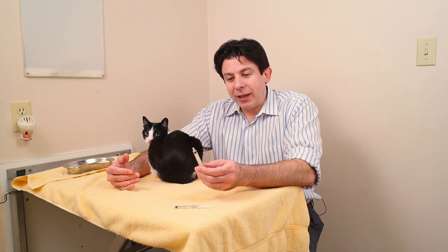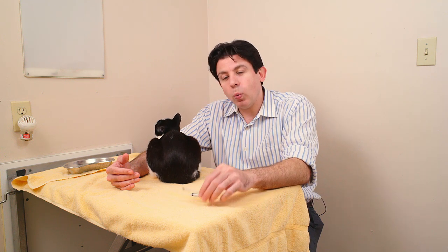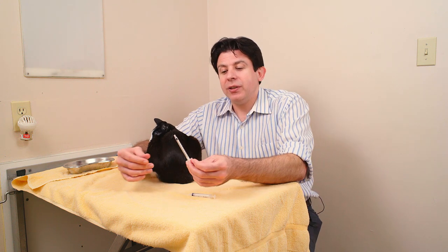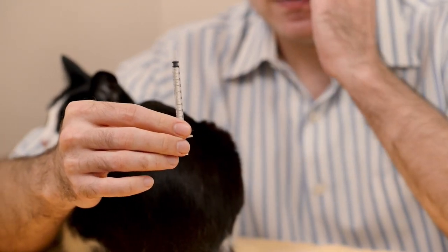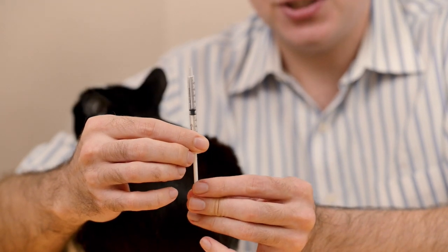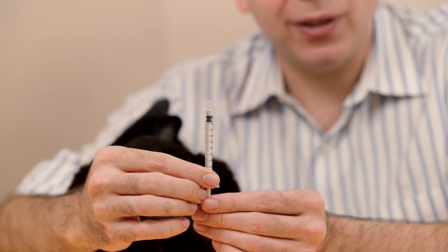Usually you will get medication in a bottle and you'll get either a 3 ml syringe or a 1 ml syringe to administer it, and it's important to know the difference. A 1 cc syringe contains a maximum volume of 1 ml of medication and it's broken up into 0.1 ml gradations. So this is half a ml, this is 1 ml, and this is 0.1 ml.